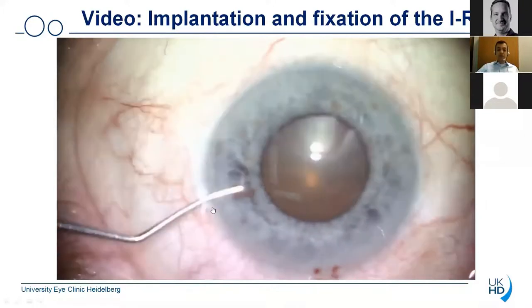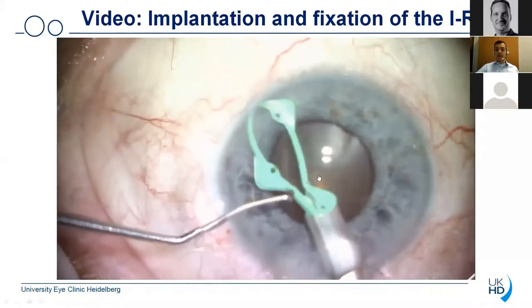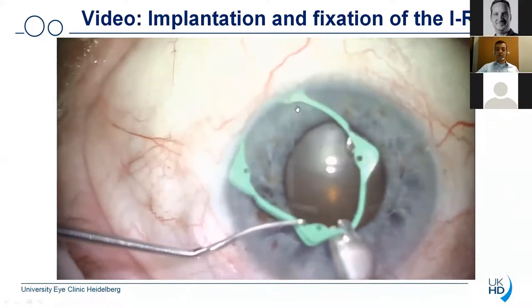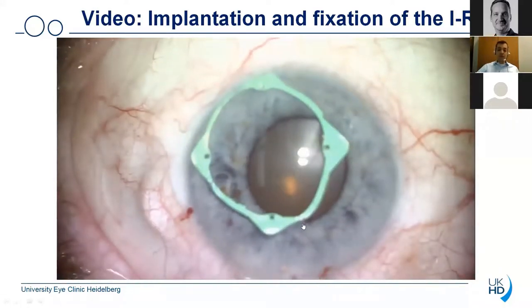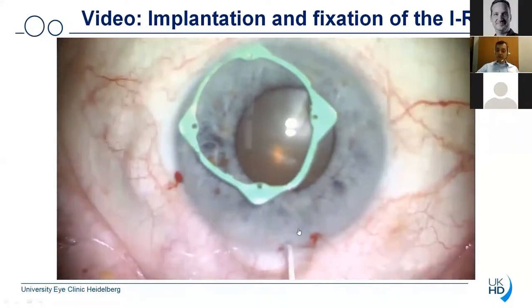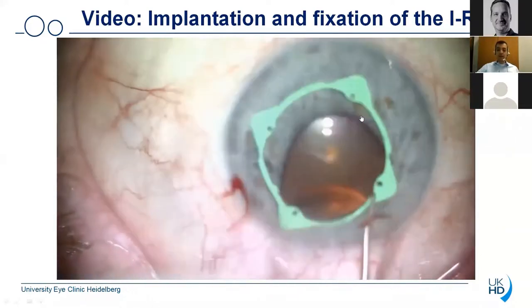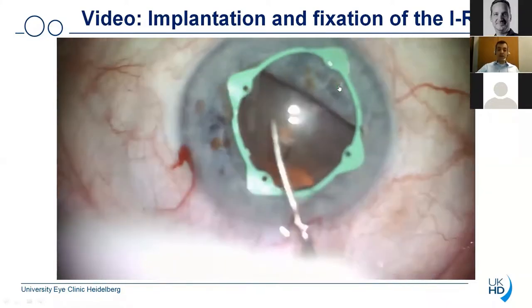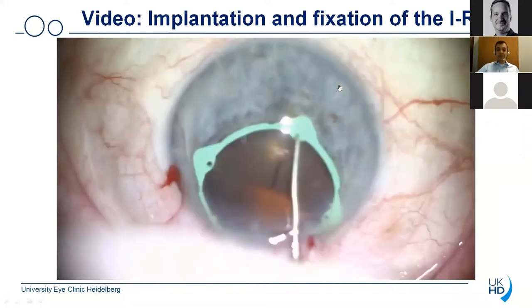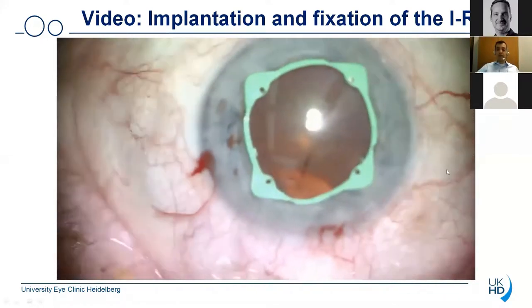You can see that you can easily use a single-handed approach. In local anesthesia cases you can fixate the eye and you can then see how the eye ring is released in the center of the eye. You see that it's very soft material and you are really doing no damage to the iris tissue. The inserter is then removed and then you need your Sinski hook to really secure the channels to the iris. In this situation I start with the proximal one and then I go to a lateral one, but in my opinion you can do that whatever way you prefer to fixate the eye ring to the iris. You can see that the eye ring is nicely in place — the pupil is now well dilated and you can very easily proceed with normal cataract surgery.